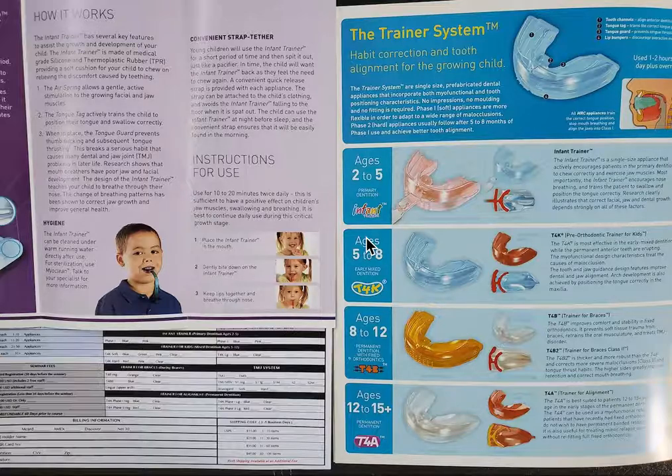For the most part, I think that the infant trainer, for ages 2 to 5, is good. The trainer for kids, the T4K, is good. They have a soft and a hard, so you might have to work your way through. It's always a good idea to start with the soft and then move your way up to the hard, right? All the other ones, I don't think are really necessary, the ones for the bigger kids.